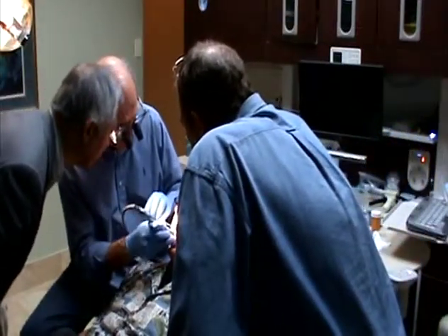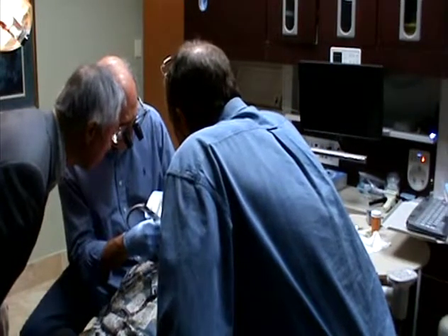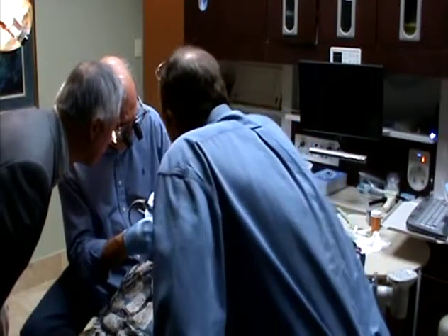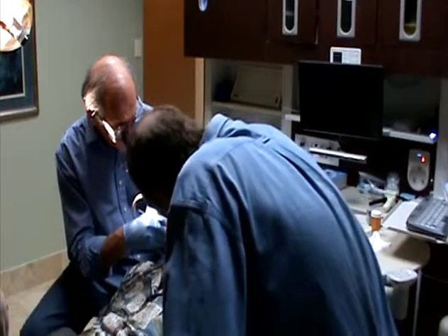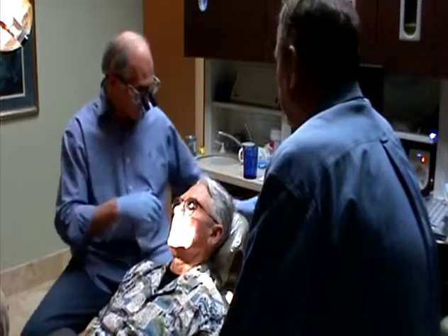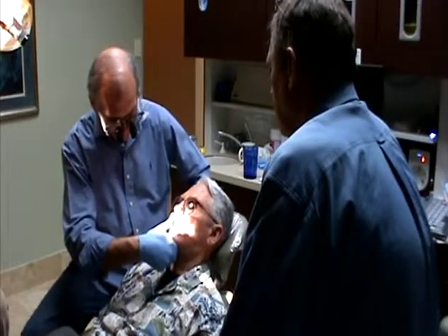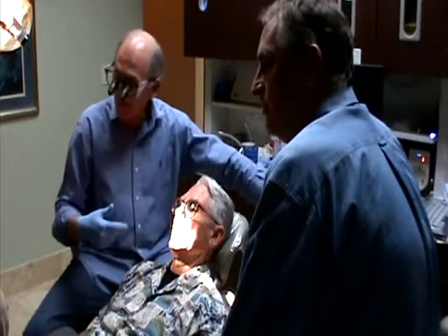It still shows up. And look at the distal buccal groove on the second molar, is there anything there? That's a green one, but not that. Just about, I'm starting to hear the contact now on both sides. Yeah, good. Level now. Is it? Take a look.